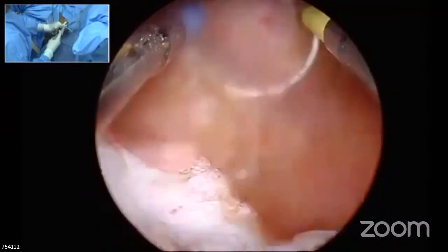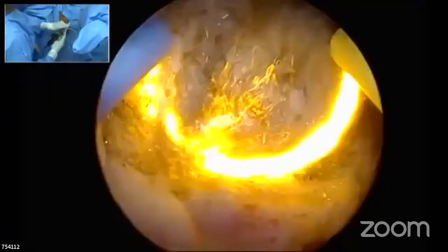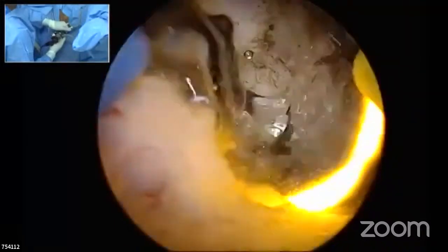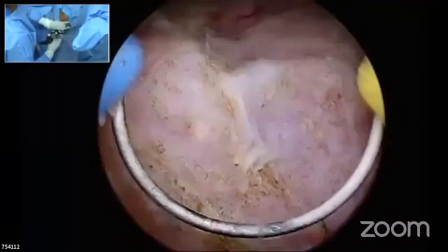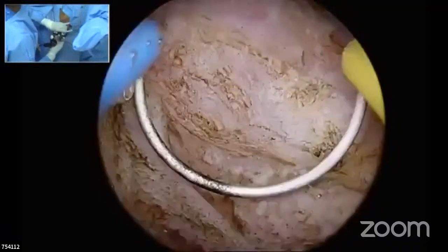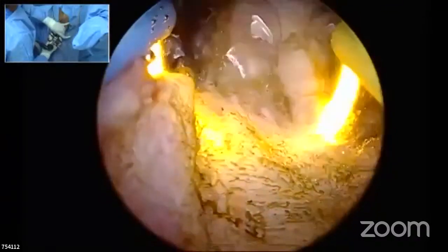So I'm coming back to the apex and trying to resect the tissue behind that, scooping the tissue away from that muscle. That is the tissue. That is the muscle. I'm trying to scoop out the tissue away from the muscle. I think so. This is very well.